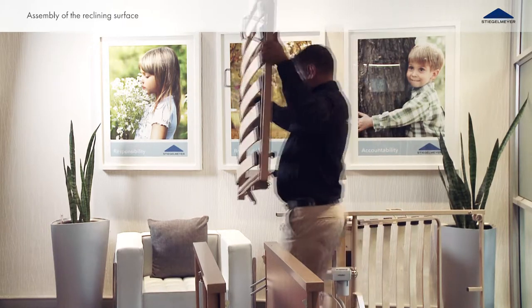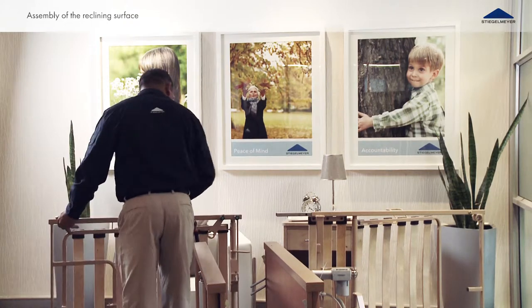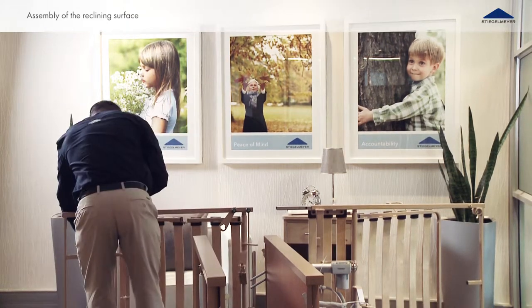Now take the foot side half of the frame and place it on the other reclining surface frame. Fold the lying surface away from the bed frame.